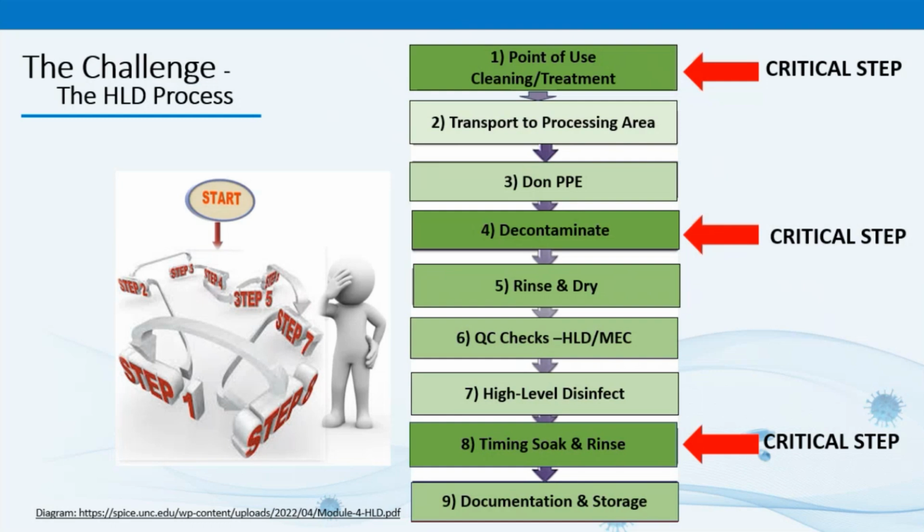In step four, decontamination, they observed not following IFUs, not using proper PPE, not visually inspecting all parts of devices for damage prior to decontamination, and also not removing those damaged devices from service and reporting them to leadership. They saw single brushes being used on multiple devices and not performing brushing underwater. Detergent IFU soak times were also not being timed.